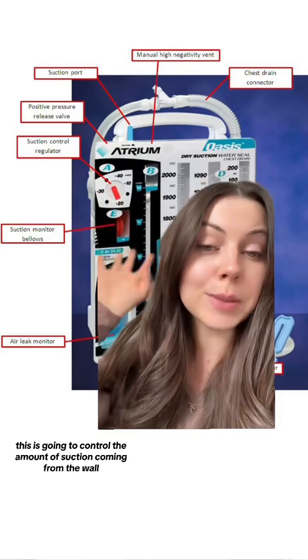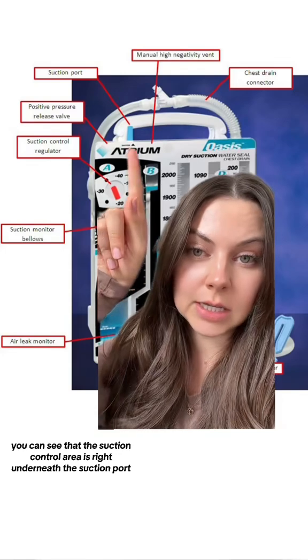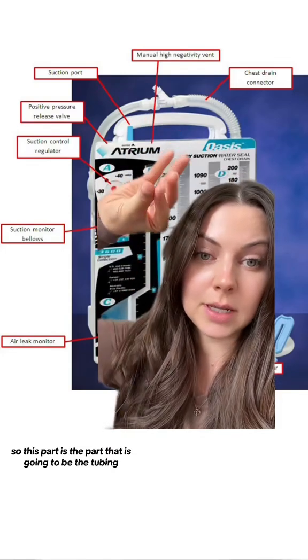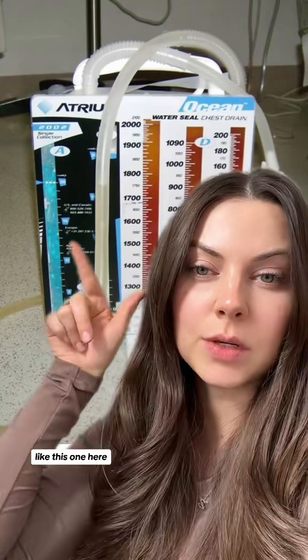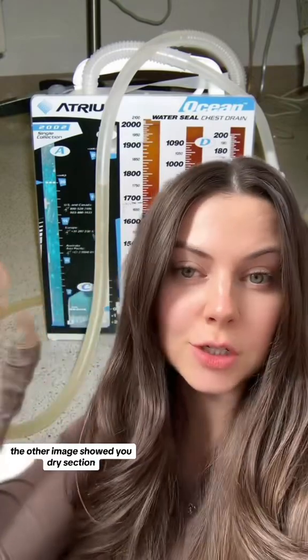And lastly, we have the suction control regulator over here. This is going to control the amount of suction coming from the wall. You can see that the suction control area is right underneath the suction port. So this part is going to be the tubing that's attached to the suction on the patient's wall. And in some cases like this one here, there is a wet suction. The other image showed you dry suction.